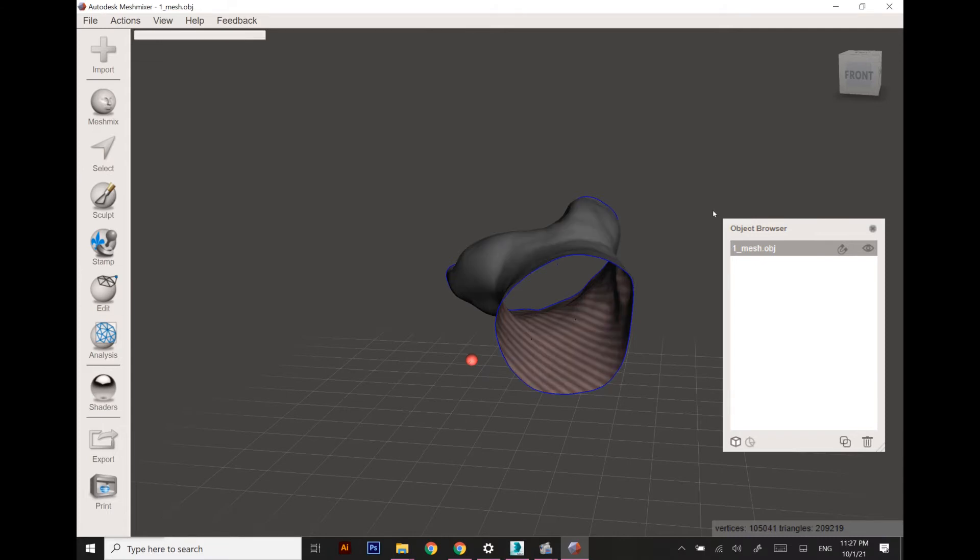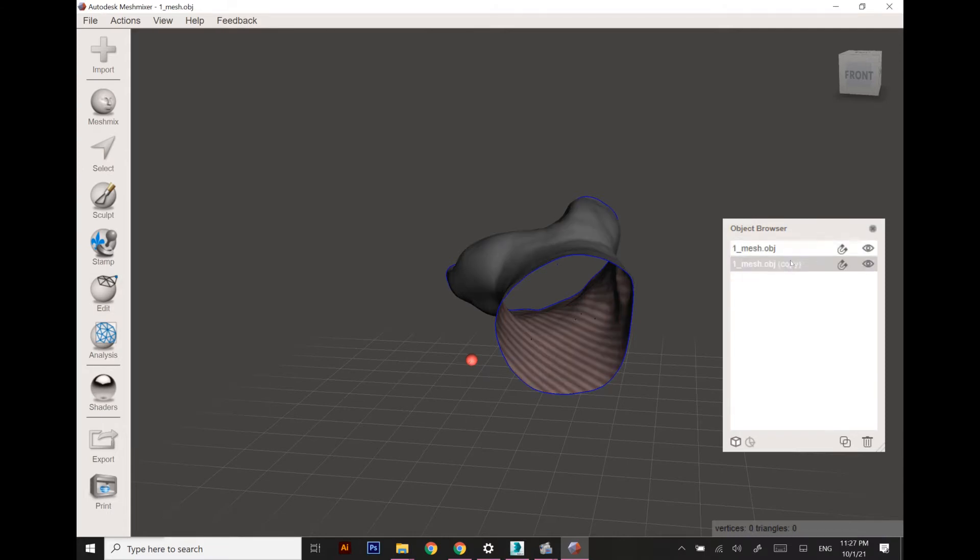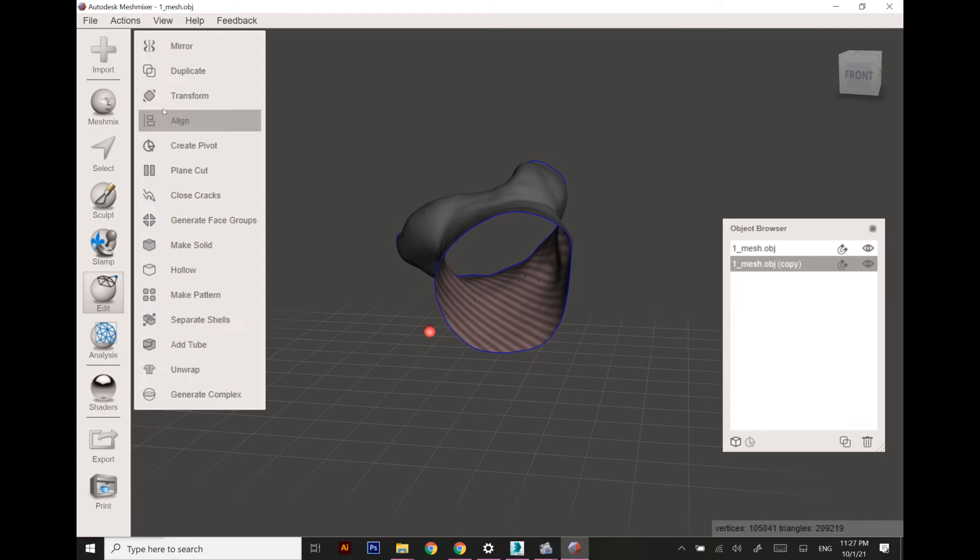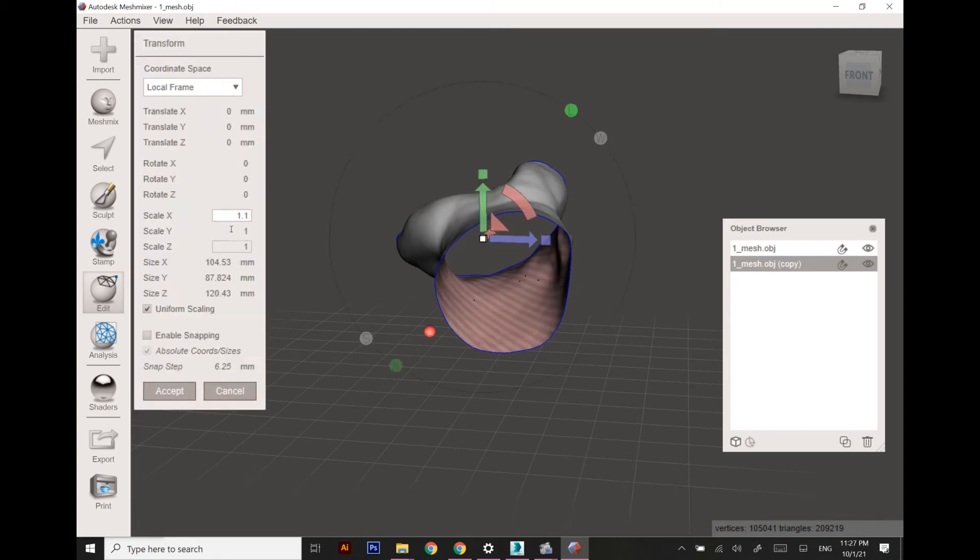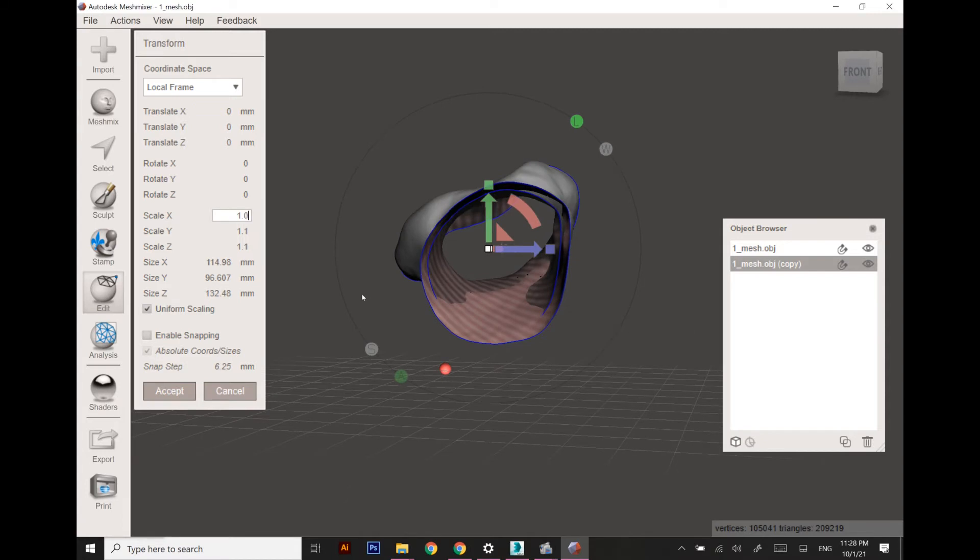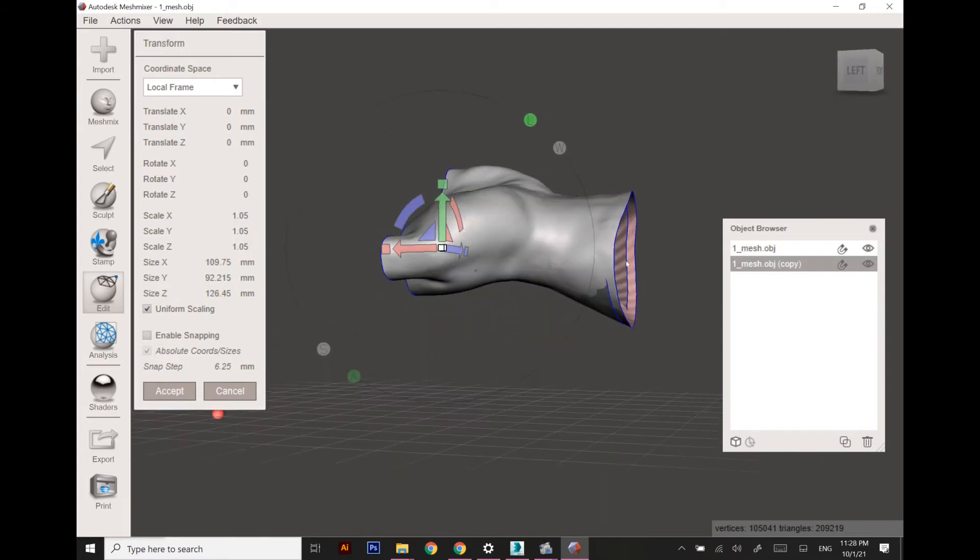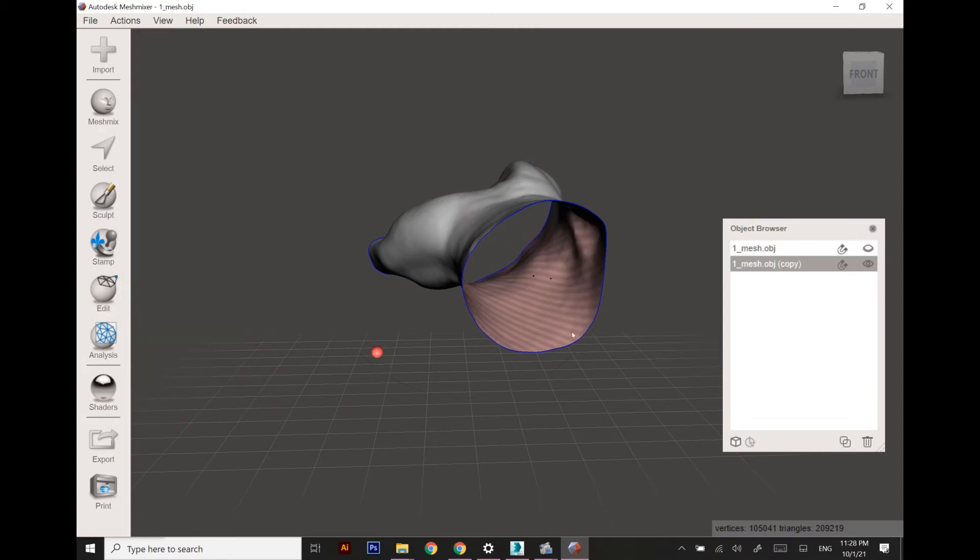Now I am going to copy this object and make it a little bit bigger for the air gap to be worn on the hand. I think scale 1.05 or 1.06 or 1.07 would be good enough.